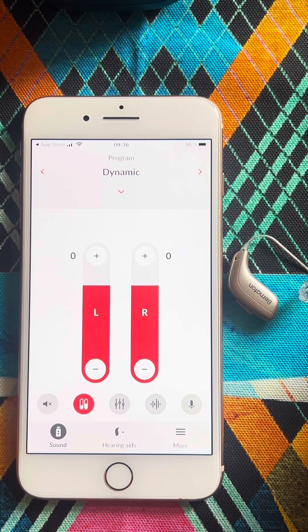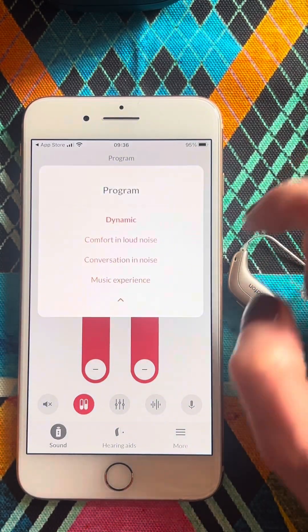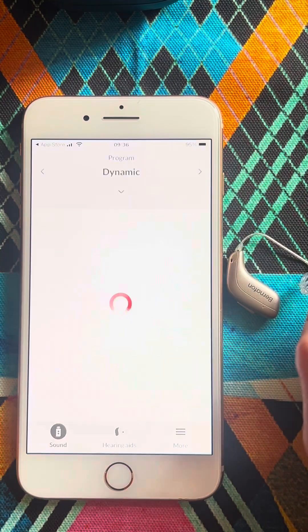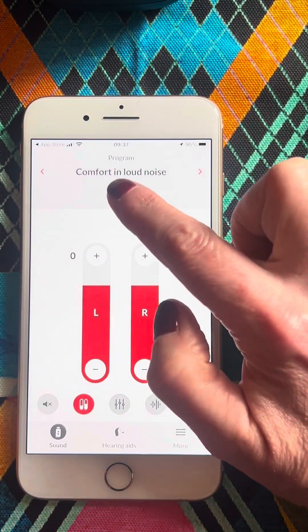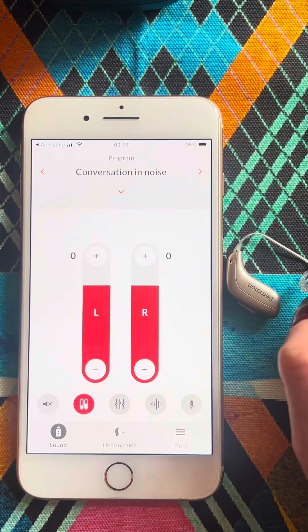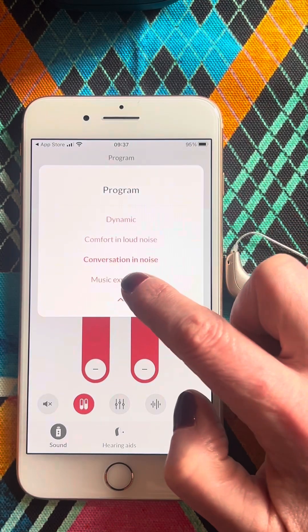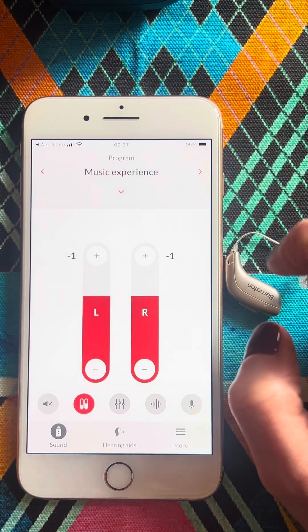Next, we're going to look at the programs. Over here we have a little drop-down arrow and we can see the different programs that have been loaded on this particular instrument. Comfort in Loud Noise is program two — that's a great program for very noisy places. Conversation in Noise is the third program, very good for hearing speech in restaurants. And on program four we have Music, a very good program for listening to live music.